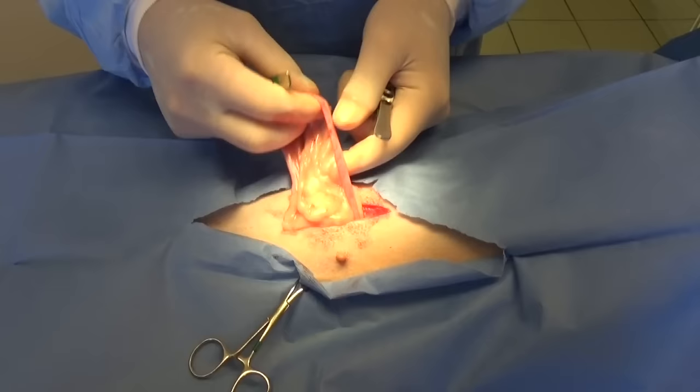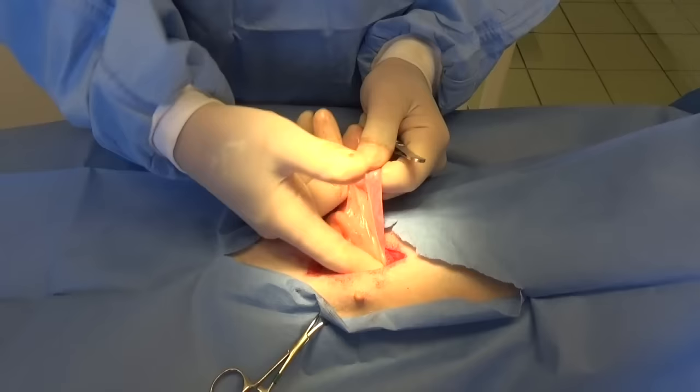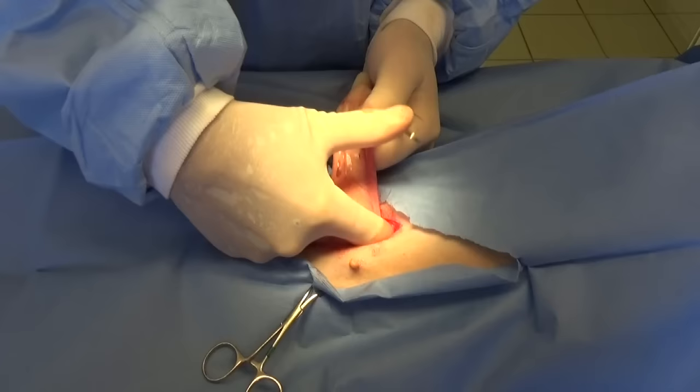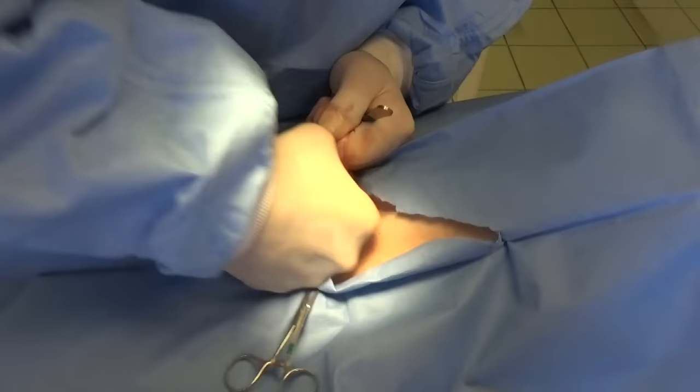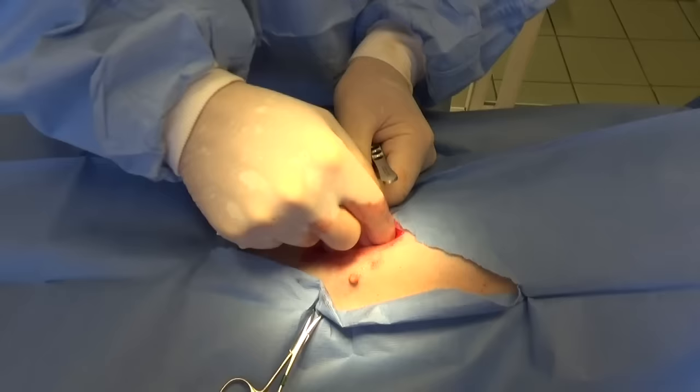See the uterus come out? Isn't that pretty? That's the uterus and all the blood vessels. So I'm going to put my finger in there and I'm going to break the ligament to the ovary. So see, look at how hard I have to pull. Push, I mean. That's how hard it is. Look at that. And I'm pulling, it's come up a little bit, but it still didn't break. Isn't that amazing? I think the body's tough. Oh, there it broke.